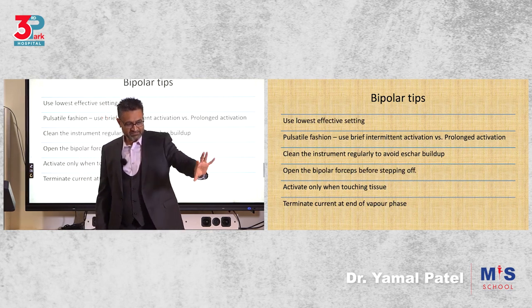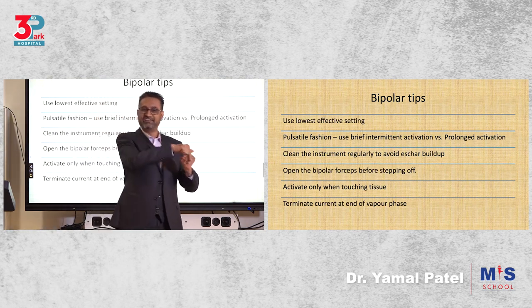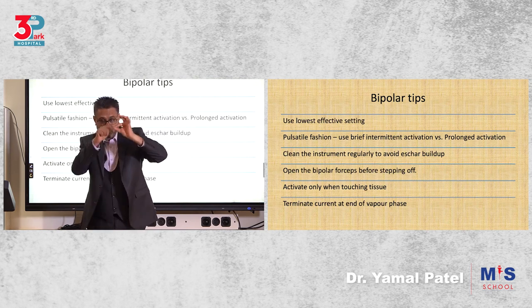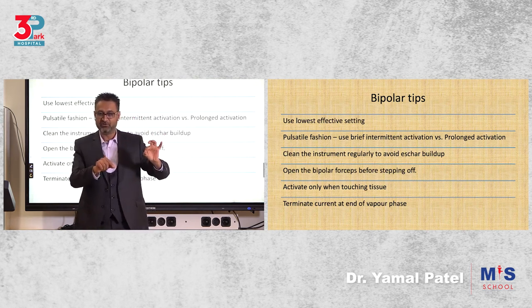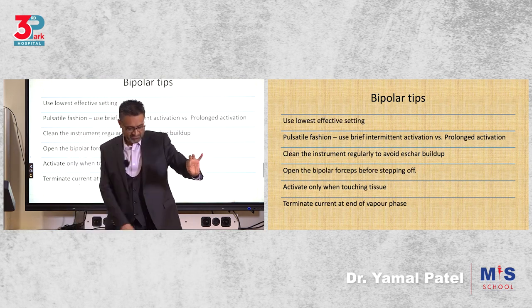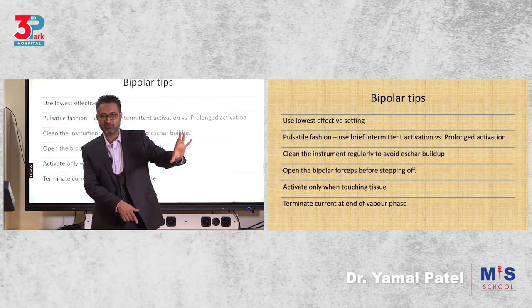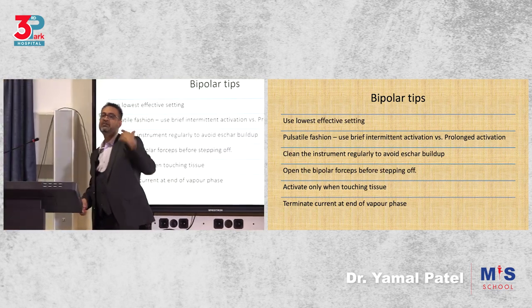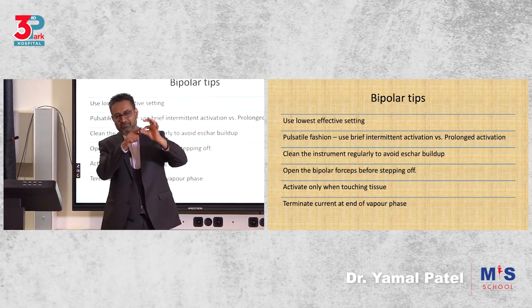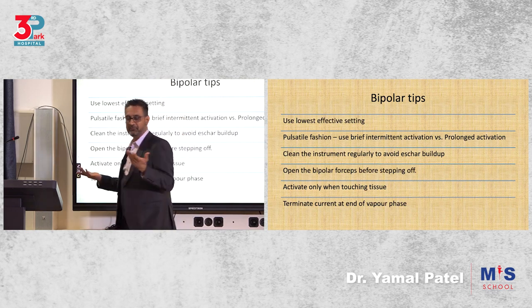Why? Because when I release this first, there is still steam. So steam will not allow my tissue to stick to the instrument. When I release the other first, this hot instrument will stick to the tissue because the steam dries up. You've got the point? So hold, activate, then don't release this, then release this. So simple small tips. You will not need to clean your instrument 20 times. Otherwise, every time it will stick with black things. You'll be giving your nurse clean, clean, clean. It becomes frustrating.